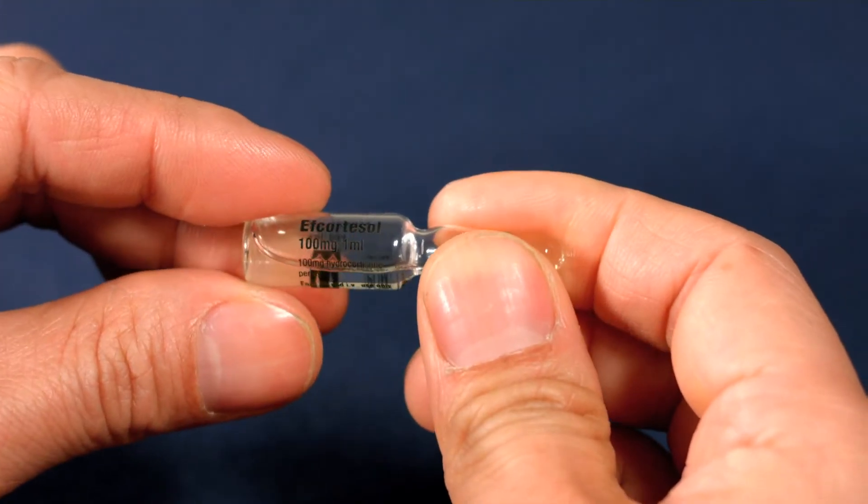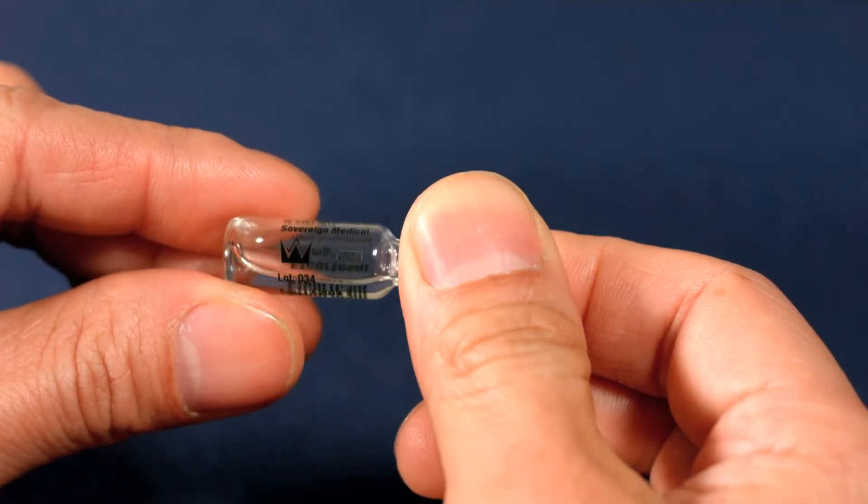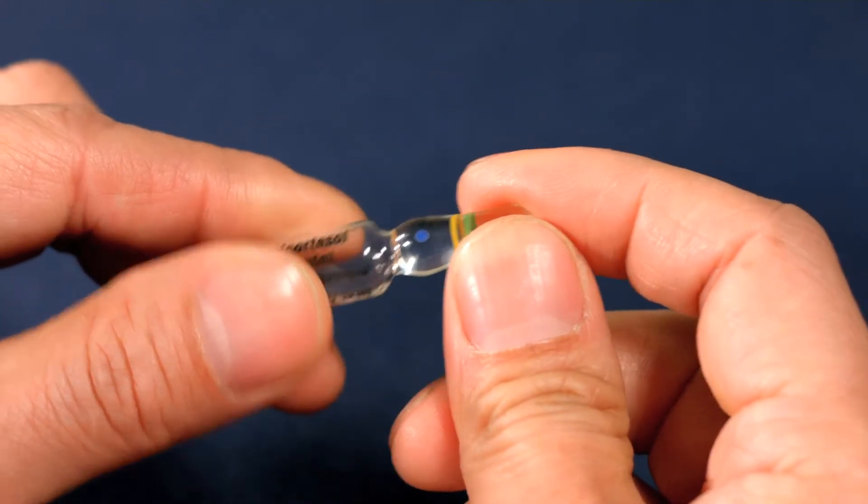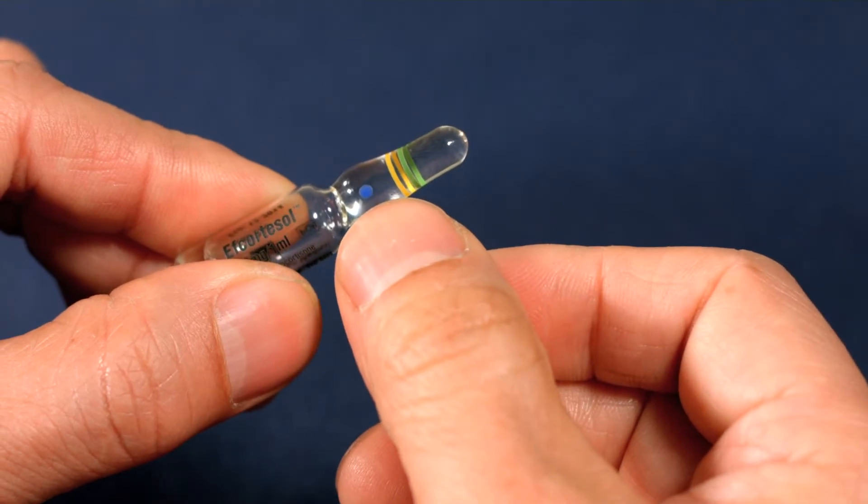Check the expiry or best before date on the bottle. If it's expired but it's the only medication you have, use it anyway. Notice the blue dot — this is the breaking point.